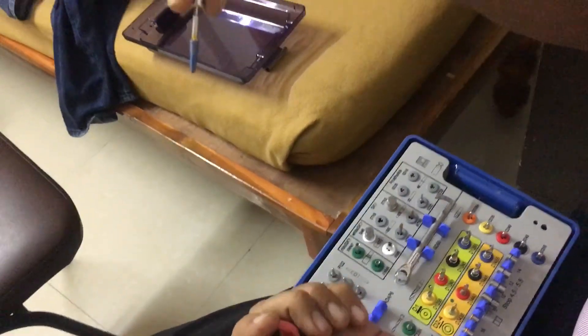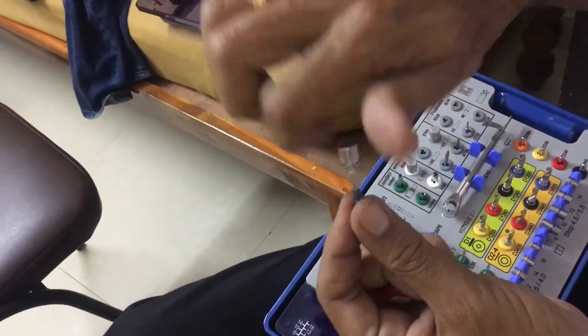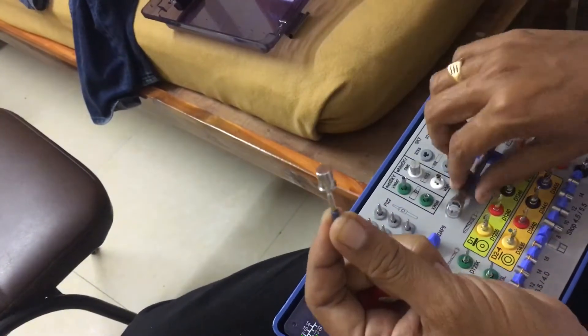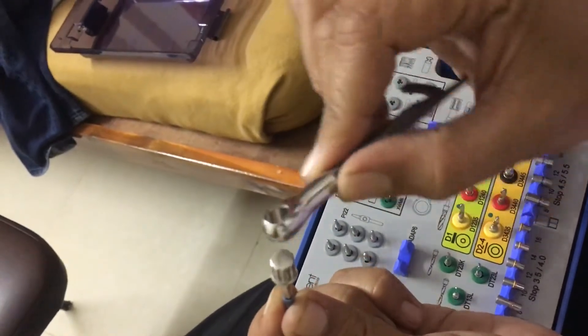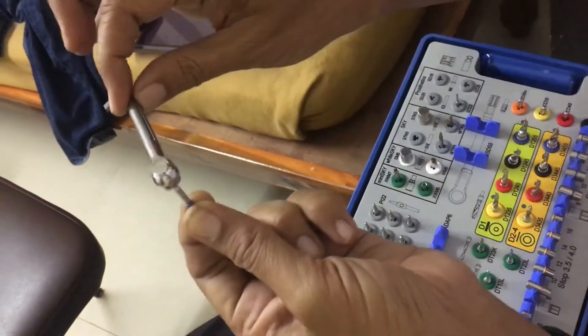The implant will not fall off. You take it to the osteotomy and fix it there. After a particular stage you will start getting resistance — you cannot do it with your hand. Use the ratchet. The indent should be facing you. Put it here, then you start ratcheting it.